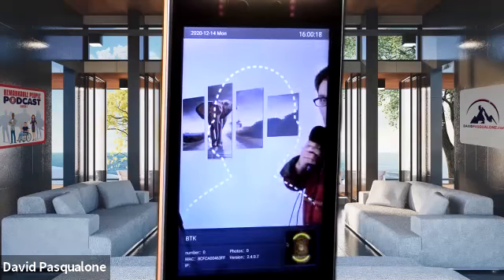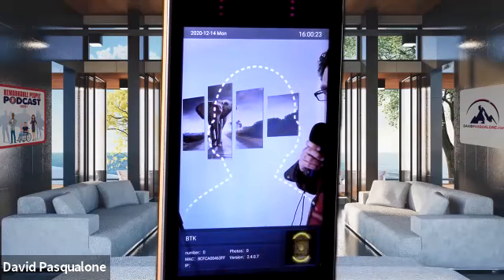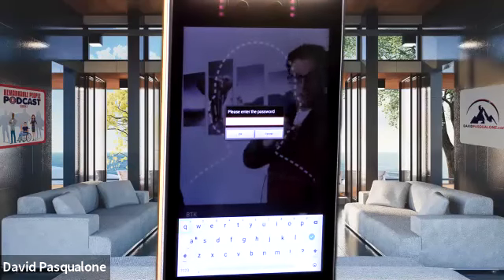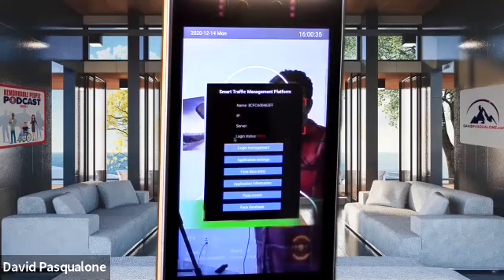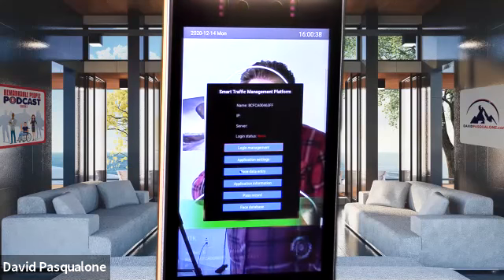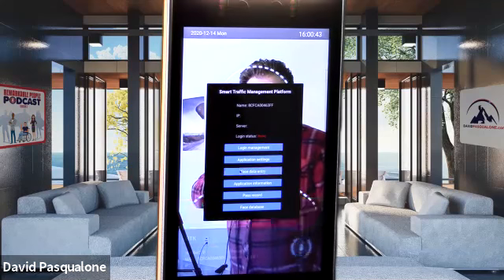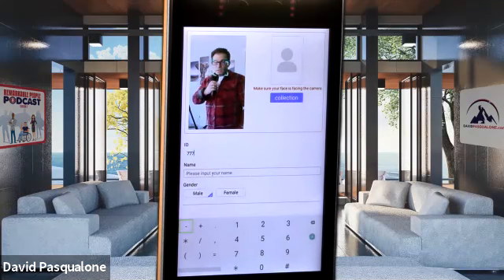Now, again, right here on the camera, it says the name. But if we did do facial recognition, let's get back into the settings. I'm going to click the magic password, 123456, hit OK. And then see this third setting? It says face data entry. So I'm going to put an ID in. This can be an employee ID or a random ID you make just for this. So I'm going to do my ID number 777.